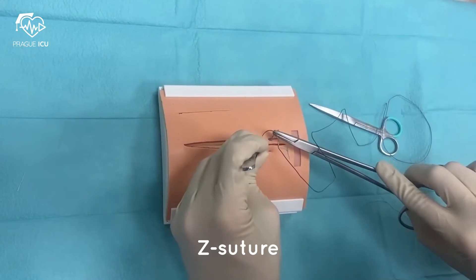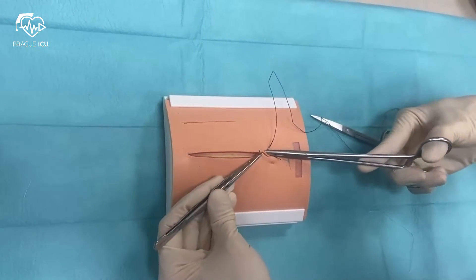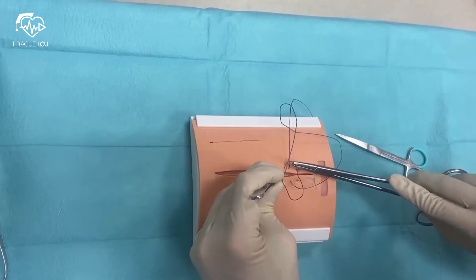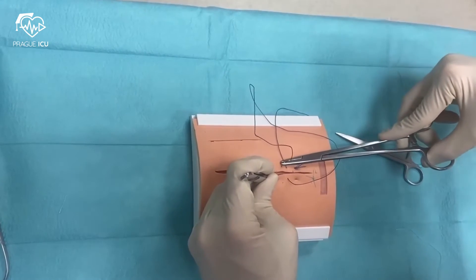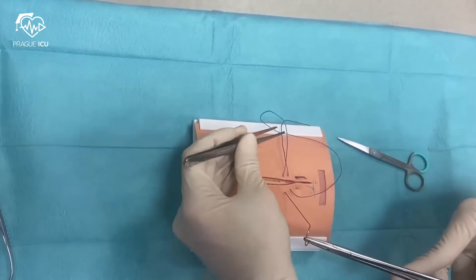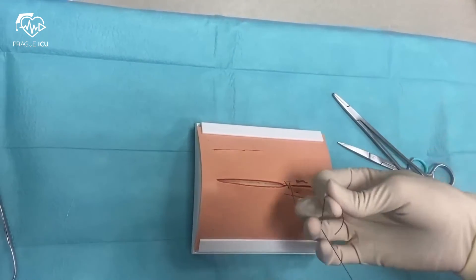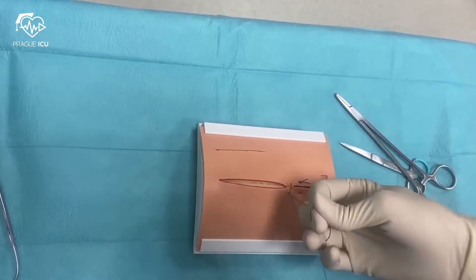The so-called Z-stitch or X-stitch differs from the previous one in that after crossing to the other side, you reinsert the needle on the original side to emerge a short distance from the first entry and take it through to emerge on the opposite side. It's commonly used after percutaneous procedures such as catheter ablations and peripheral ECMO decannulation.